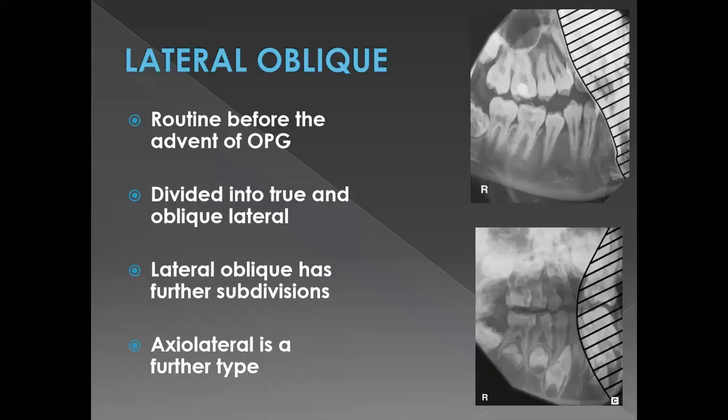All right, coming to the last X-ray that we'll be studying, and this X-ray, the lateral oblique, was very routine before the advent of the orthopantomogram. However, since OPGs are now extremely commonplace, you will find very few centers, if any, doing the lateral obliques. All right, there's a question over here.